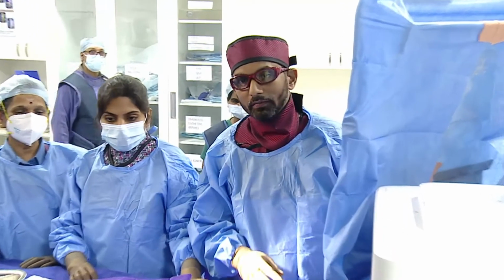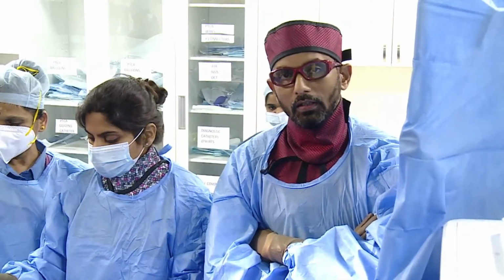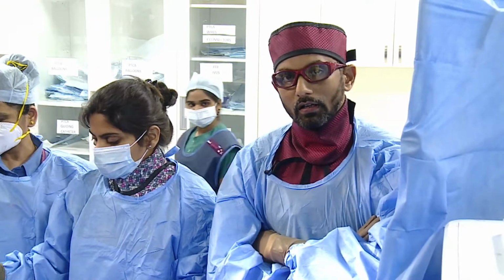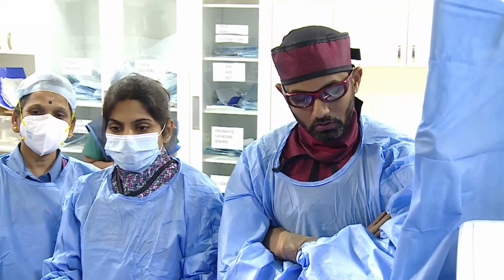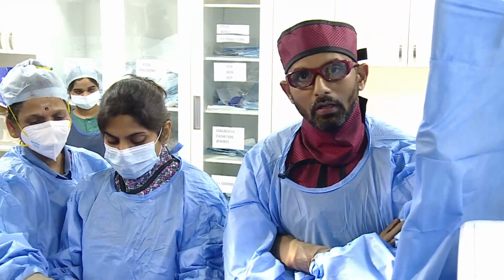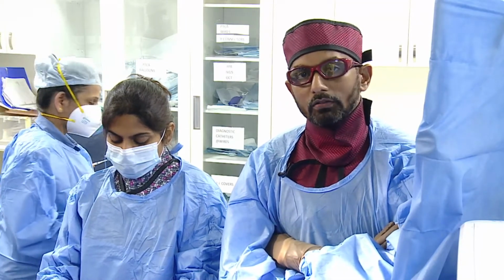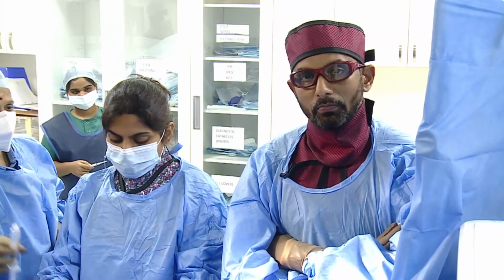Good morning all. So today we have a live in a box case of a possible planned transradial rotablation for an LAD in a 75-year-old gentleman. So this gentleman had CABG, coronary artery bypass surgery, many years ago. Had LIMA to LAD and RIMA graft to the obtuse marginal and SVG to PDA.